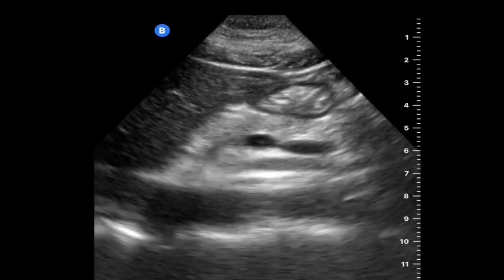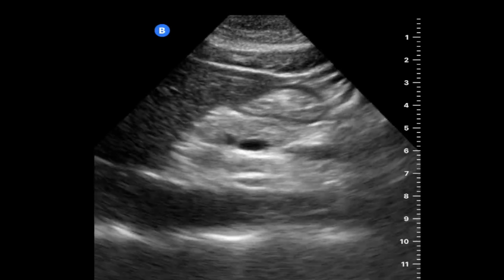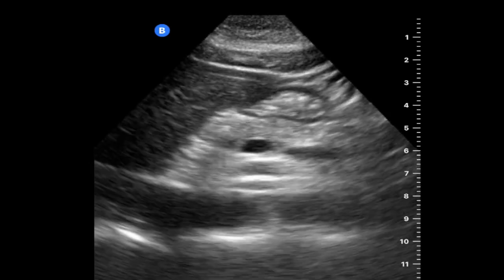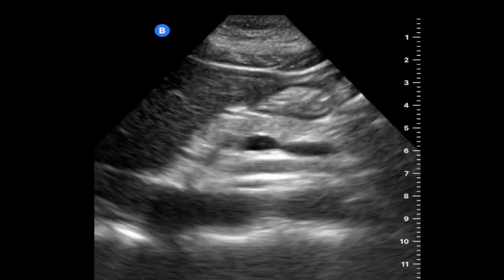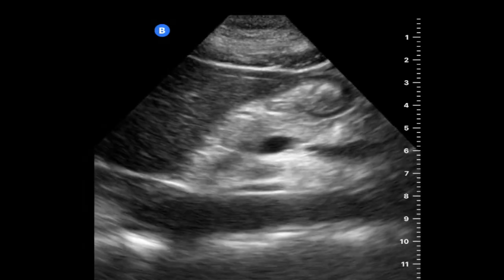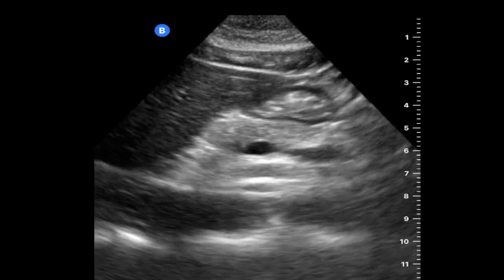The appearance of an empty stomach on an ultrasound typically resembles a bullseye. This is characterized by a small or collapsed antrum, which is surrounded by the distinct sonographic layers of the stomach wall. These layers are sonographically distinct and provide a clear outline of the antrum. In many cases, even a physiological empty stomach contains a small volume of clear liquid, which represents baseline gastric secretions. These secretions are a normal part of gastric function and help to maintain the stomach lining. The presence of this small amount of liquid does not indicate that the stomach is not empty, but rather reflects the normal physiological state.